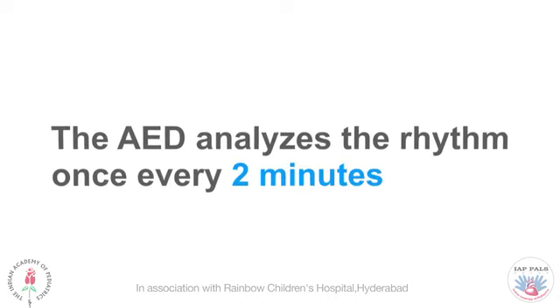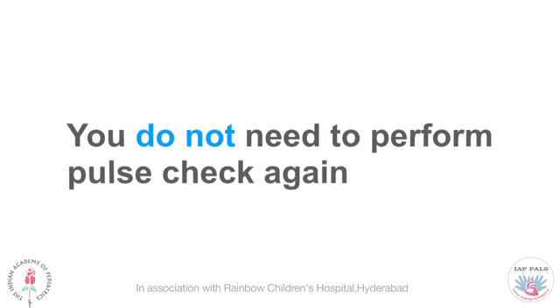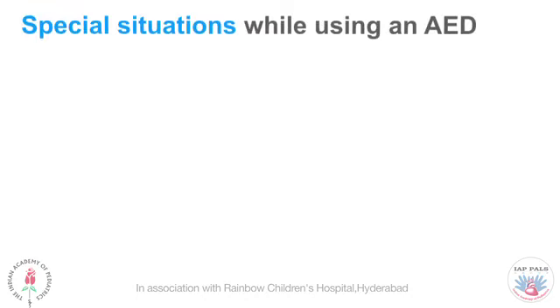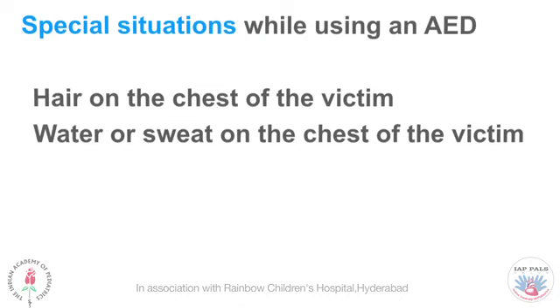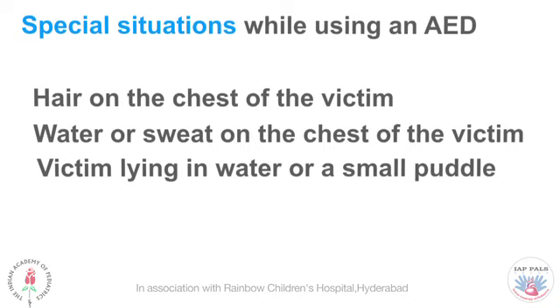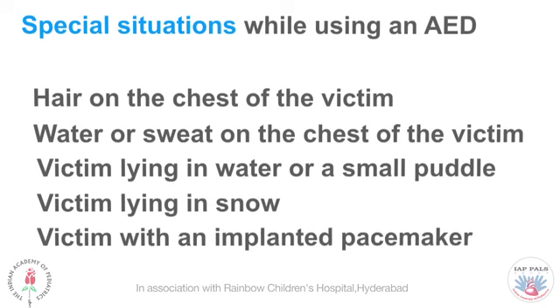The AED will analyze the rhythm every 2 minutes. If no shock is advised by the AED, resume chest compressions. You do not need to perform the pulse check again. You need to consider some special situations while using an AED, such as hair on the chest of the victim, water or sweat on the chest of the victim, a victim lying in water or a small puddle, a victim lying in snow, or a victim with an implanted pacemaker.